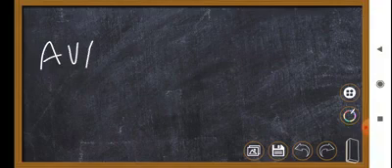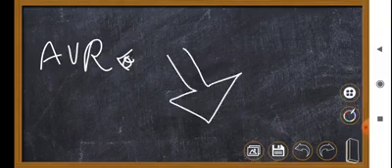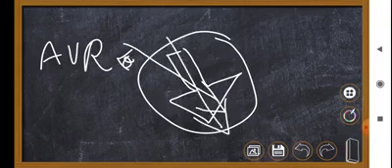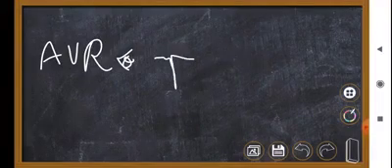That's why, as we have already discussed, lead AVR looks at the heart from the right side. It has already been mentioned in the previous lecture that the net vector of the electrical current is like this. If this is the heart, as the current is moving away from AVR here, the normal person will have the QRS complex in AVR like something like this.